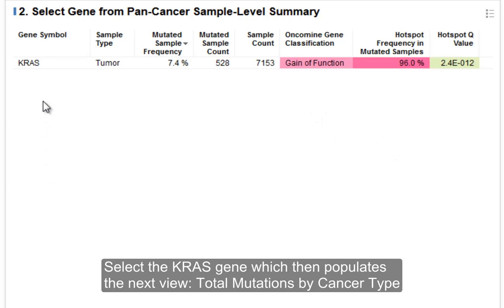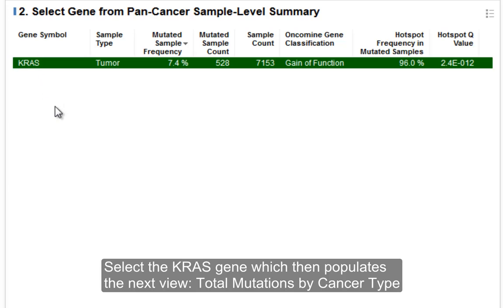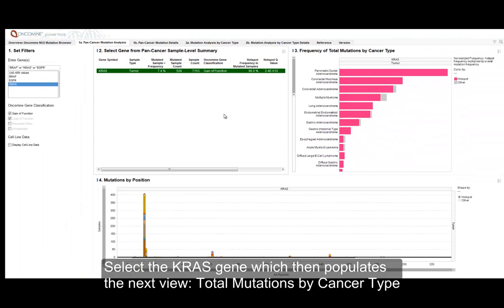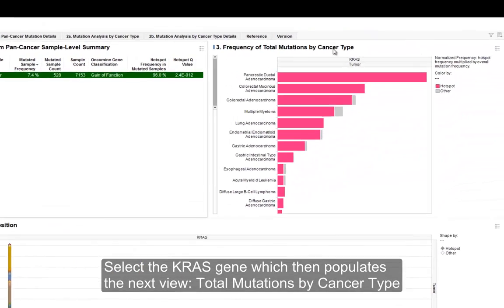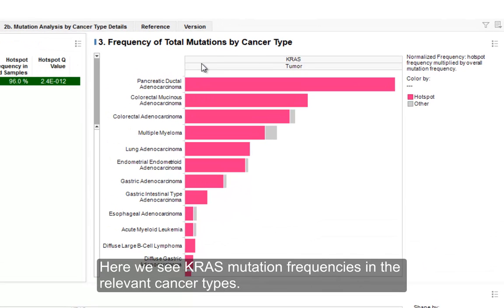In order to explore further, we click on or select the KRAS gene. That populates this next view — total mutations by cancer type — and we can see that KRAS mutation frequencies are shown in the relevant cancer types.